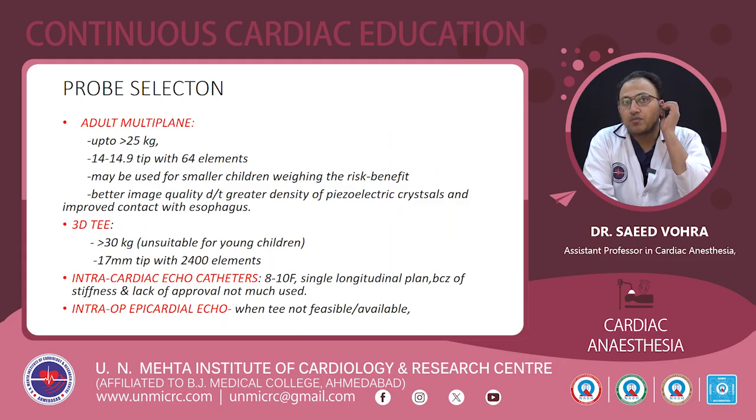Adult multiplane probes can be used in a child of 25 kg or greater. The tip diameter is 14 to 14.9 mm with 64 elements. It can be used for smaller children, of course weighing the risk and benefit of a larger probe. The large probe, obviously the adult multiplane probe, will give the advantage of better image quality due to greater density of piezoelectric crystals and improved contact with the esophagus.